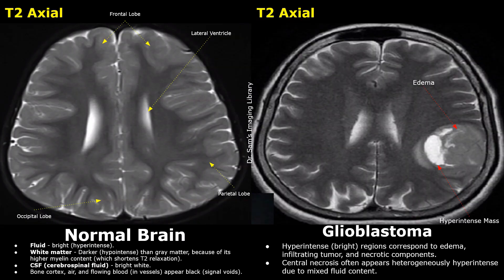This mass is heterogeneous, with these brighter areas having more cystic necrotic components and these less bright regions having more solid components. Edema is also noted here.